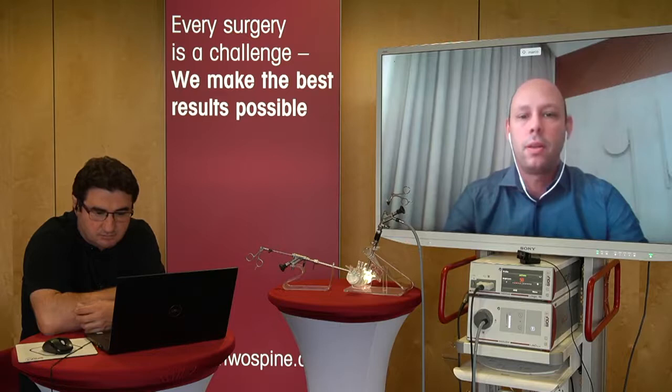And the other question is about severe foramen stenosis with osteophytes. Yes, we can remove the osteophytes with the trephine, with the scissor, and it's easier. It's not difficult. Also, you can use the diamond burrs, the manual trephine, and the scissor.